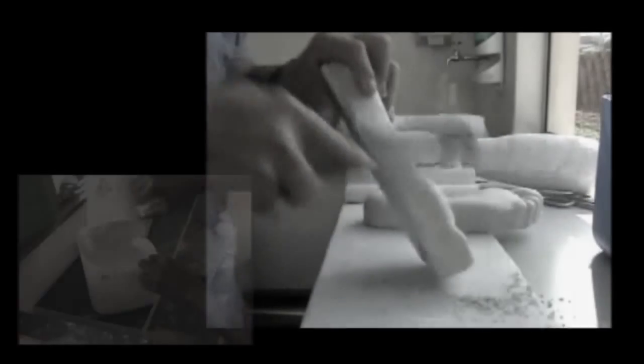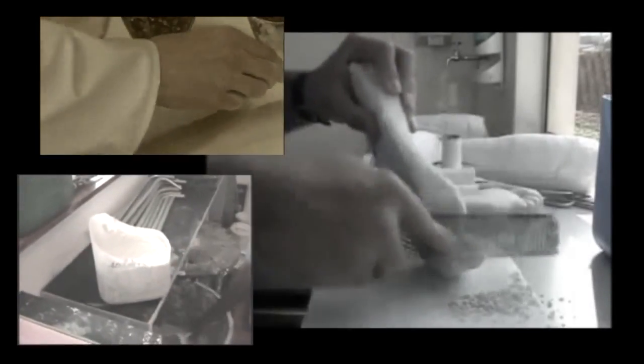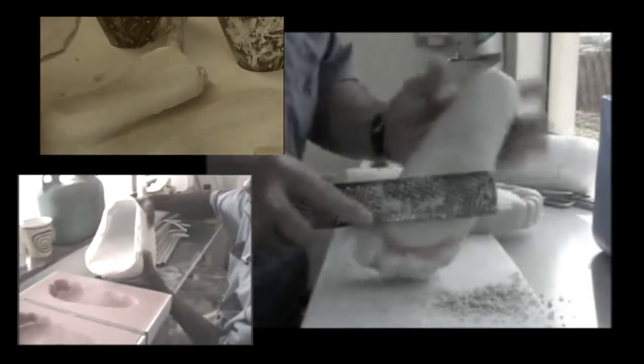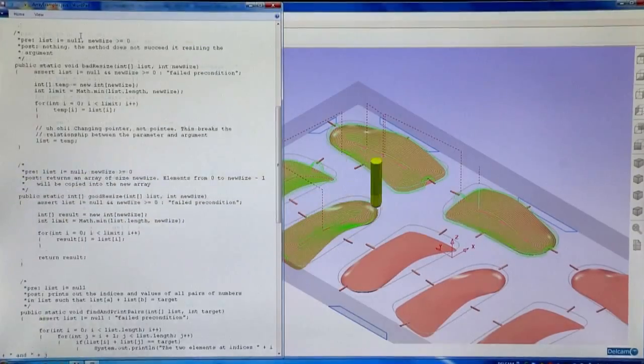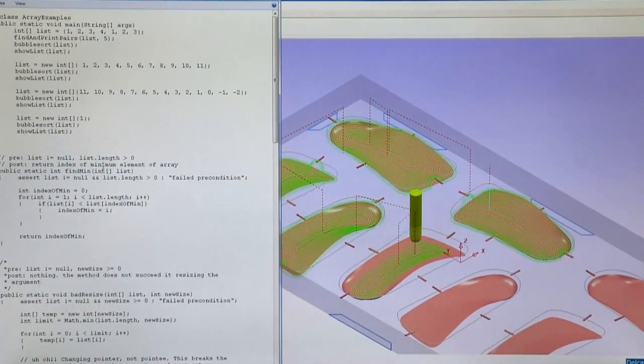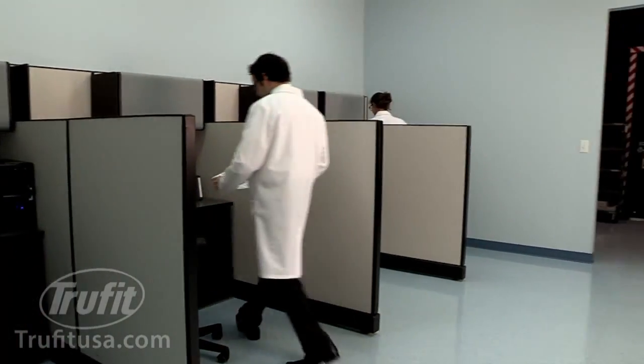At almost all other orthotic labs, this process is done by hand, using poorly trained low-skilled workers and is prone to major errors. At TrueFit, because the process is completely digitized, human errors are eliminated before the orthotic is even milled.